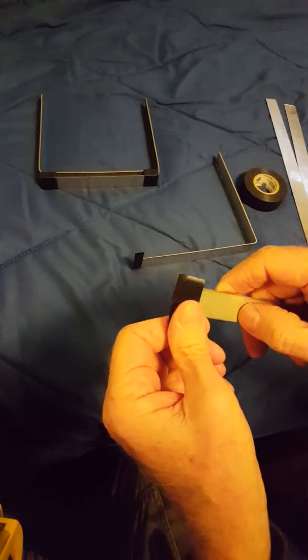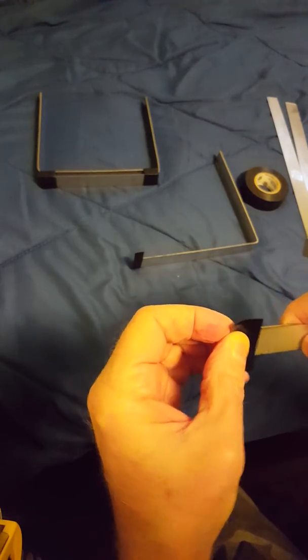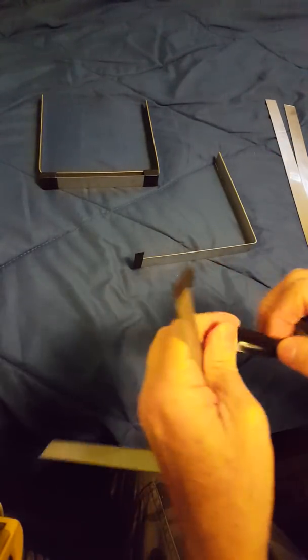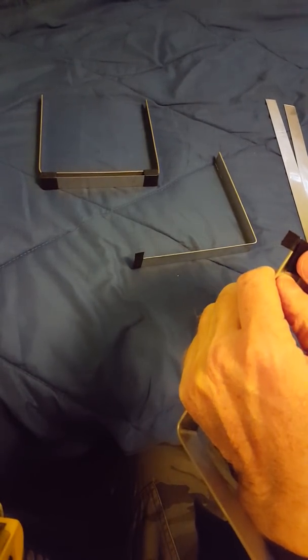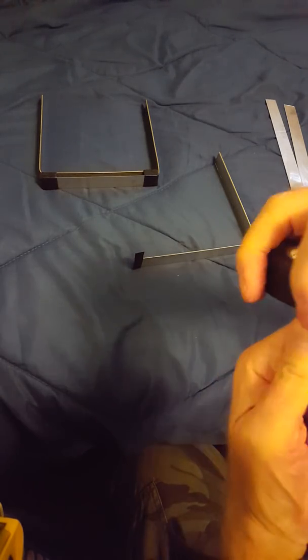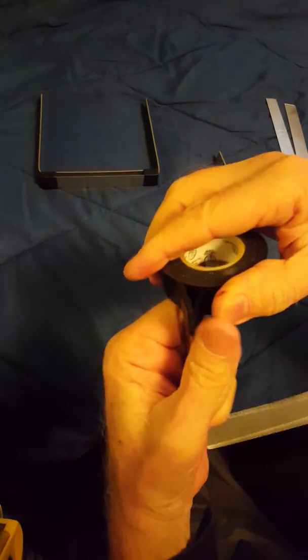Do the same with the other one. Tape over it, about halfway. Like that. Then you just take your electrical tape and you start doing laps. That's one thing with this particular design. You do a lot of laps with electrical tape. Okay, let's get this toward the end here. There we go. And what, about 3, 4, 5, whatever. So you're wrapping this up. Sorry if I'm going on screen there.